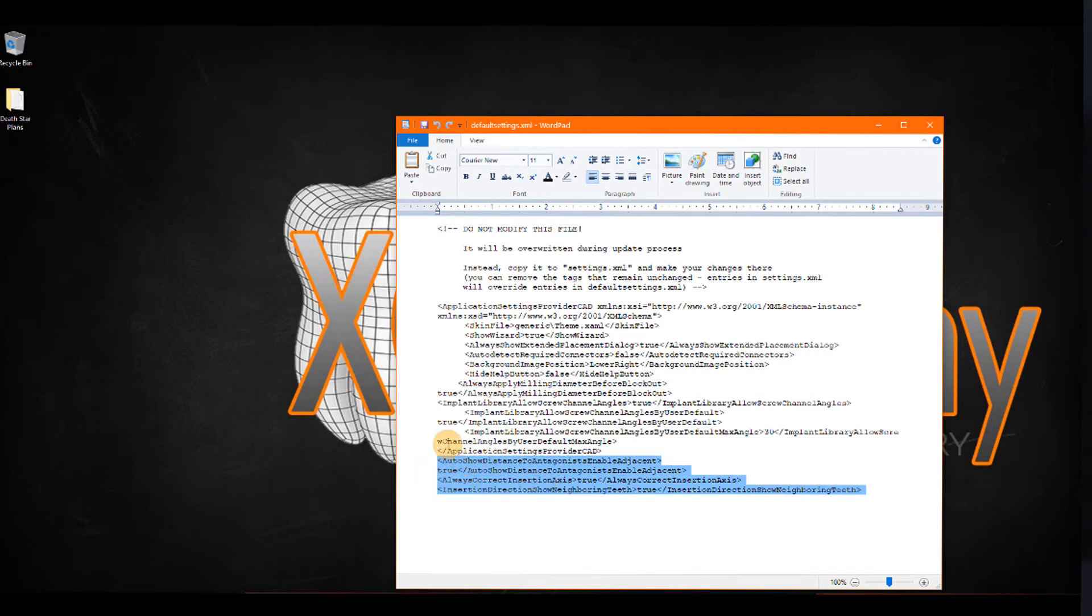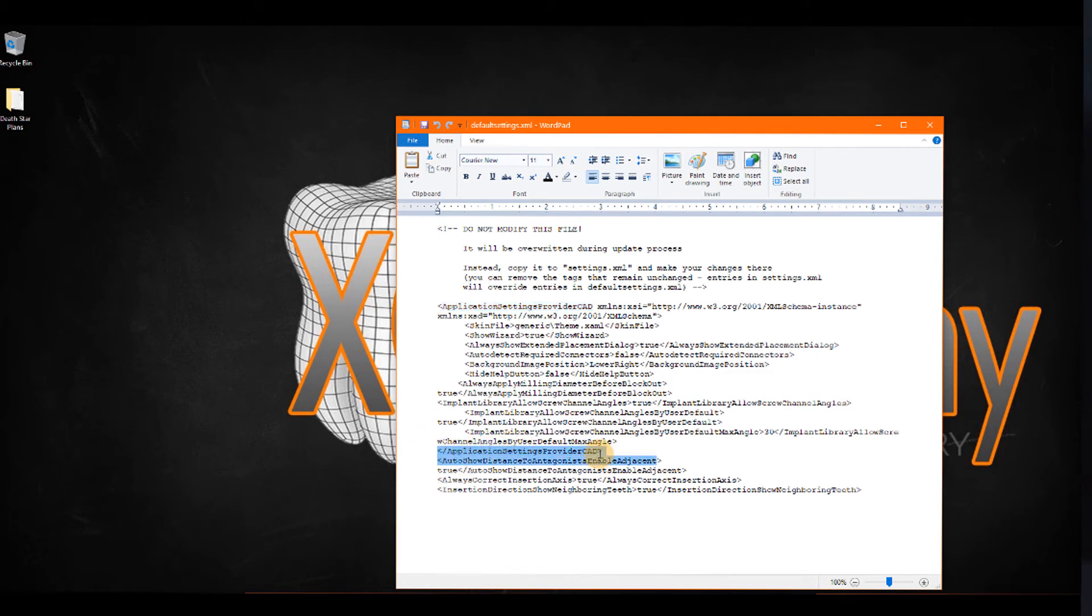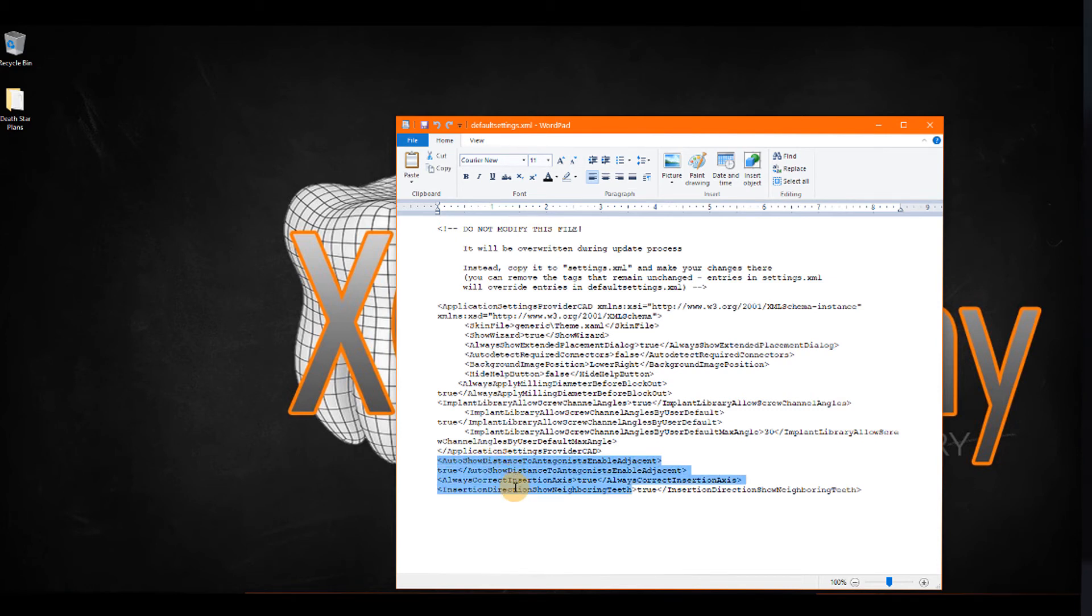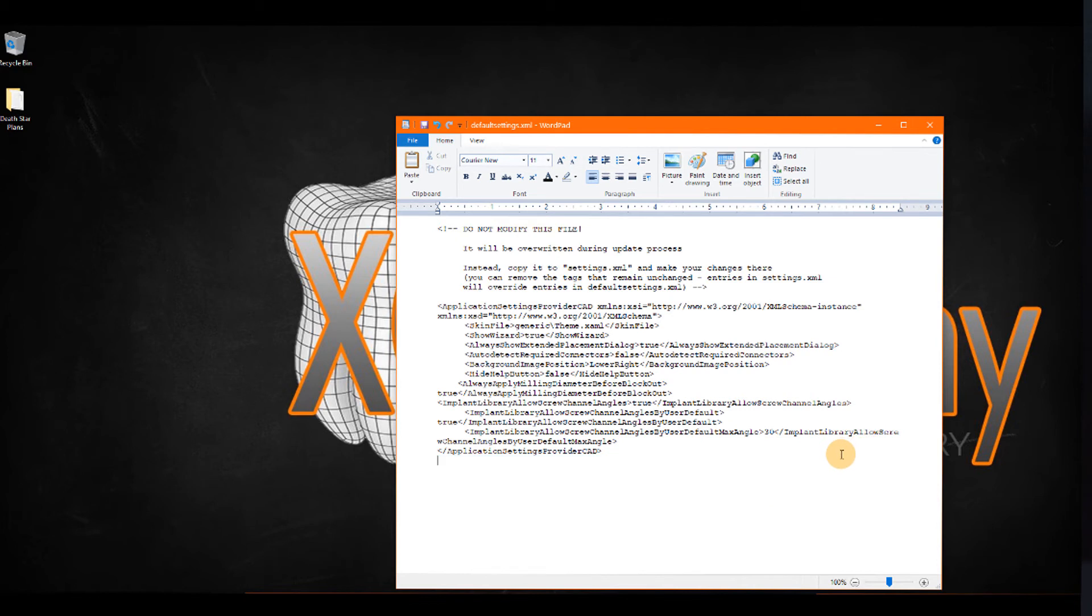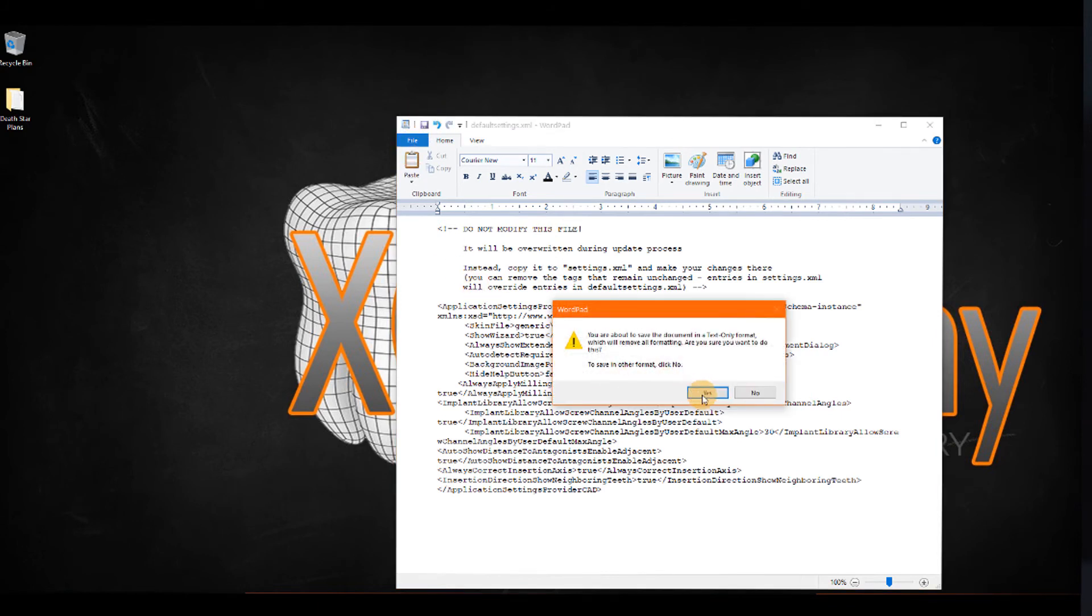But I put them outside of the application settings provider CAD tag. You can see at the very beginning, we've got application settings provider CAD, as the start of our XML file. And then we have it at the end here, and all of our settings need to be within those start and finish tags. So, I have to take my three tags, auto show distance to antagonist enabled adjacent, always correct insertion axis, and insertion direction show neighboring teeth. So, I'm going to cut and paste right before the end of our closing tag. And now I'm going to save the XML file.